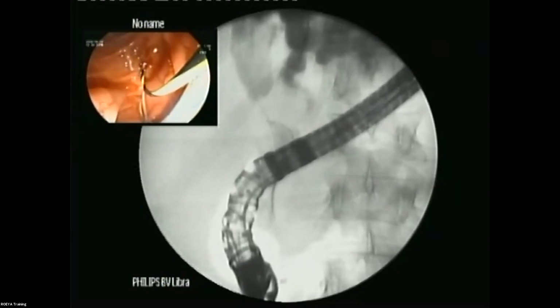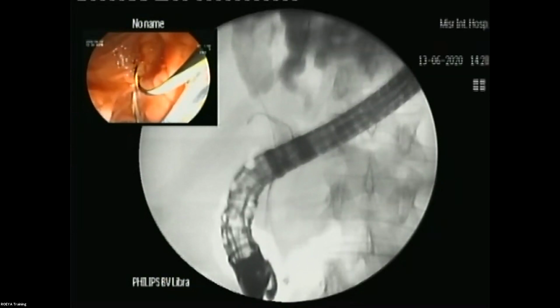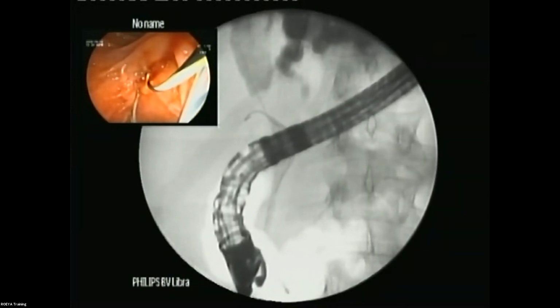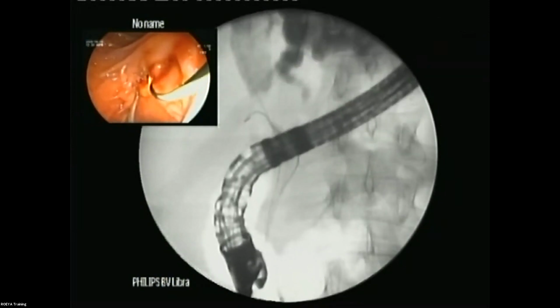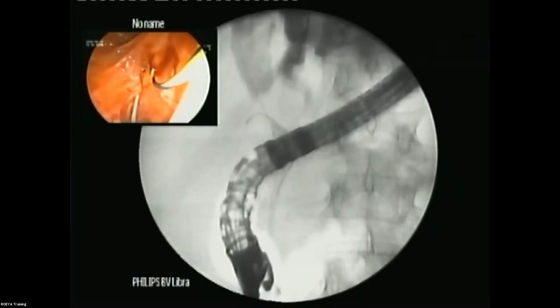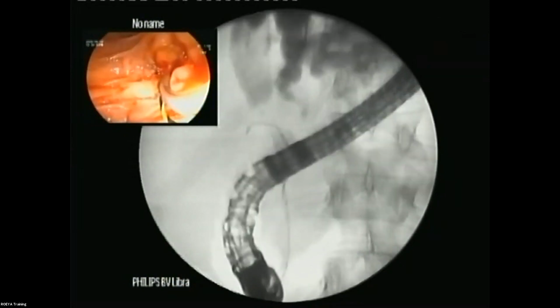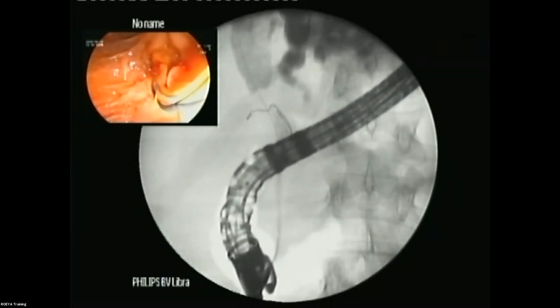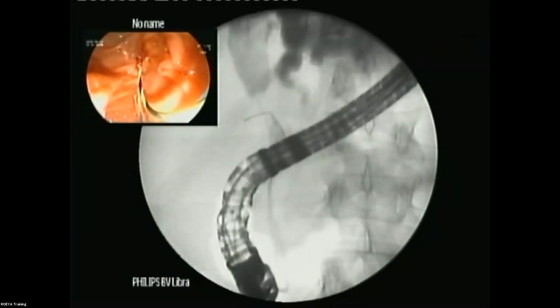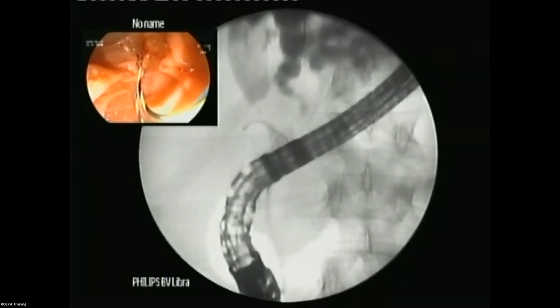The problem now, as you can see in the MRCP, is that the tumor itself is totally blocking access to the right segment. We injected contrast from the common bile duct, and all the contrast went to the left system, not to the right. Hani will try, and Salma will try, for a couple more minutes to cannulate the right system, and then we will see.